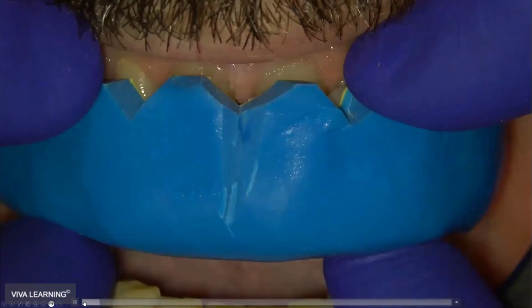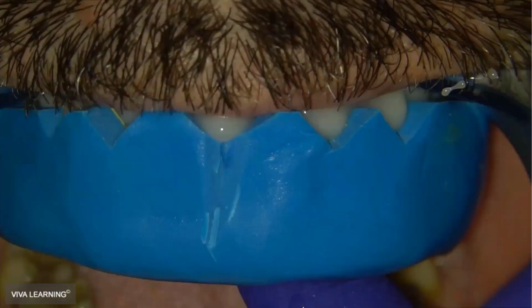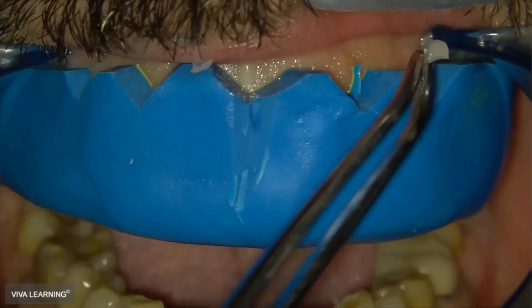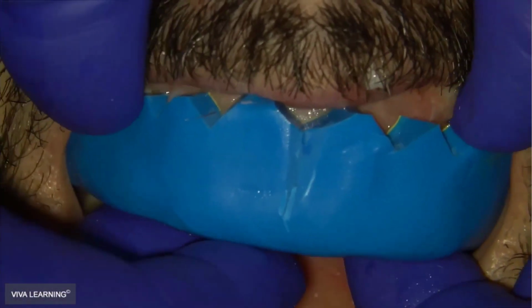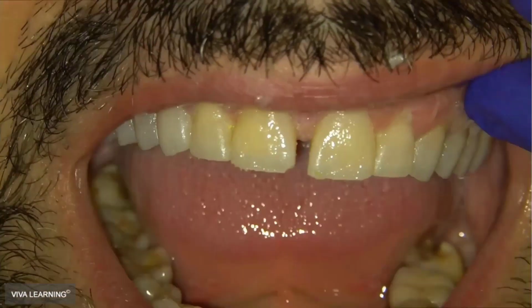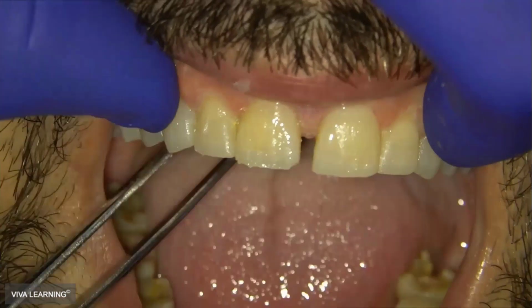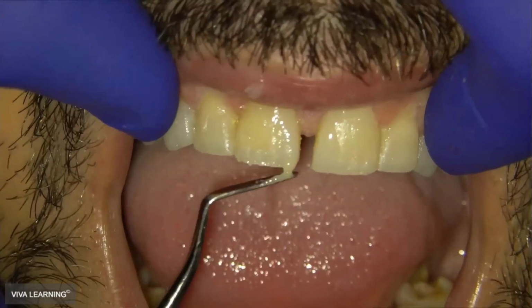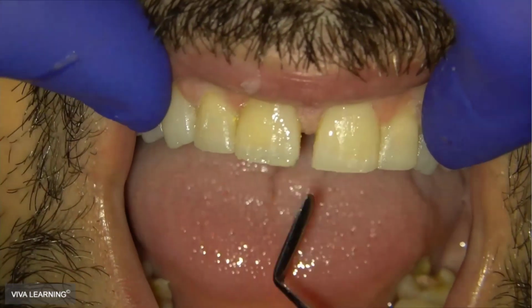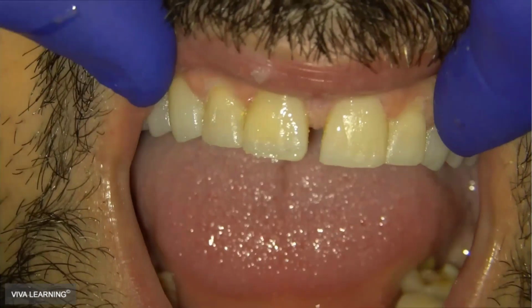Okay, so place it in the mouth, leave it for 3 minutes. The material has a very small contraction that allows it to stay locked mechanically. And by doing this mock-up, you can talk to the patient and have an idea about the shape and how he feels with the new vertical dimension.